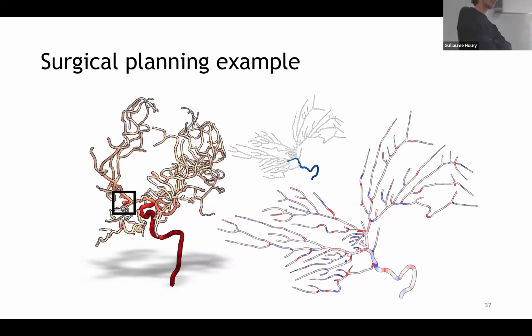And basically, a young radiologist would maybe pick a catheter, try to insert it, but it does not have the correct flexibility, the correct bending properties, and basically is not able to reach the aneurysm, so you have to take it back, and then you need another one, and basically you wait quite a lot of time, so you waste a bit of money. Like I think each catheter is on the order of 500 euros or something, but most importantly, those kind of interventions are super dangerous, actually. Like I think you have a 1 in 10 chance of dying, or something like that.